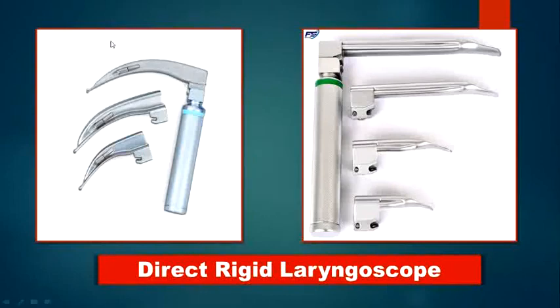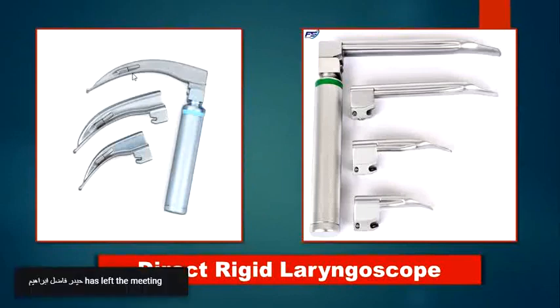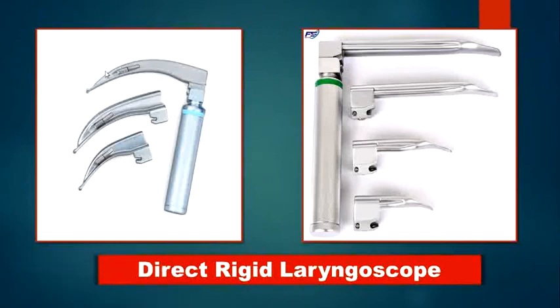Direct because it goes directly to the larynx, not like the indirect one using a mirror that is used by the otolaryngologist. And rigid because it is rigid. This is metal, not fiber. And laryngoscope because it goes inside the larynx or makes an inlet to the larynx.